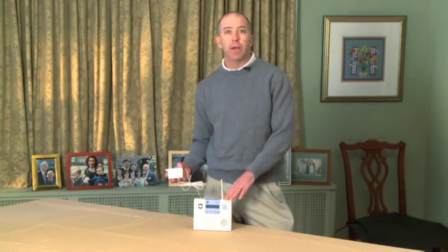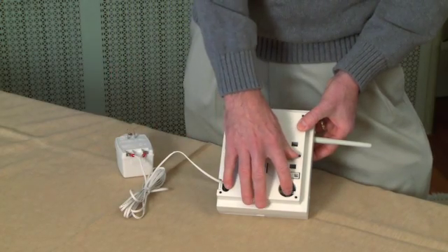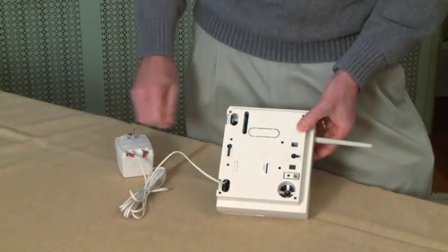Two, it needs to be in a place where there's good cell phone reception. It has a battery that'll last up to a day if power's out, but you plug it in and then all you have to do is press this button on the back and it's live.